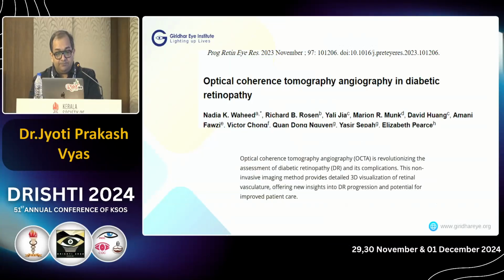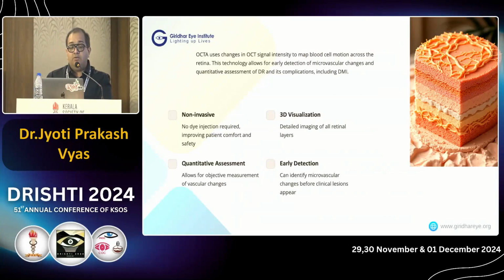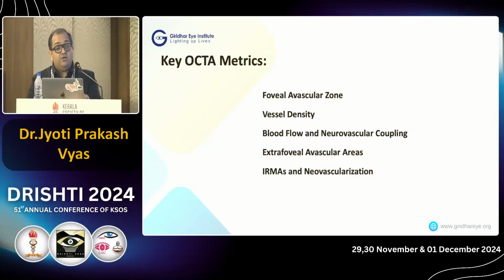Another article, which was published last year, was again on OCTA assessment in diabetic retinopathy. They found that since it gives you a 3D visualization of the entire structure, they found out the key metrics which had to be studied in this.